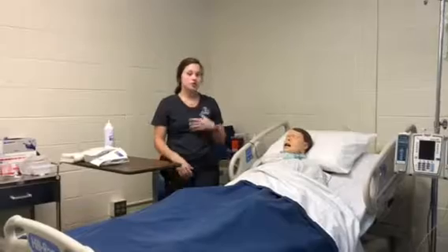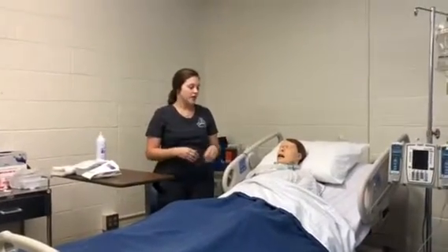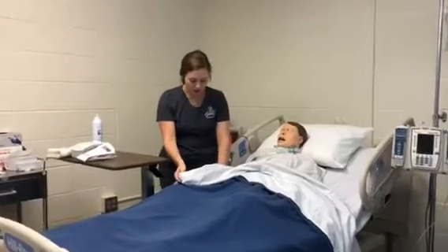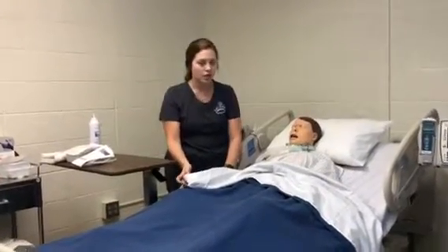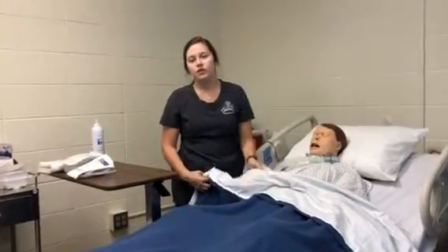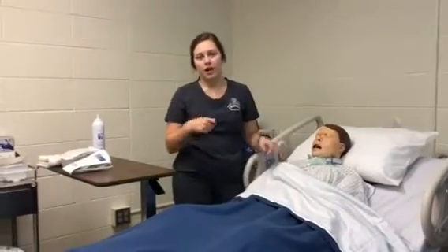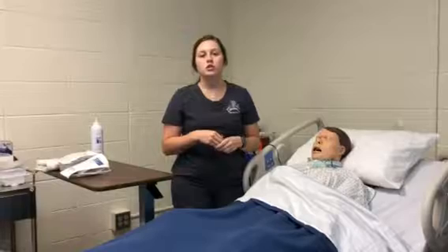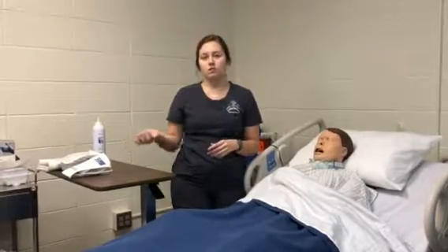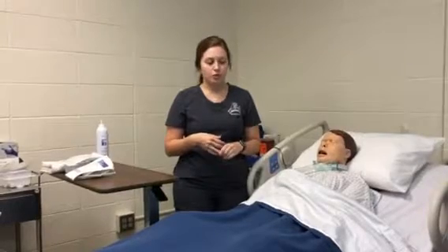So you'll want to introduce yourself to the patient, and then you'll want to check their ID band for name and date of birth. Some patients with the trach can't communicate with you, so you'll have to figure that out with your patient, whether it be writing their name or just you saying the name and them nodding, or double checking with other documents to make sure it's actually your patient.